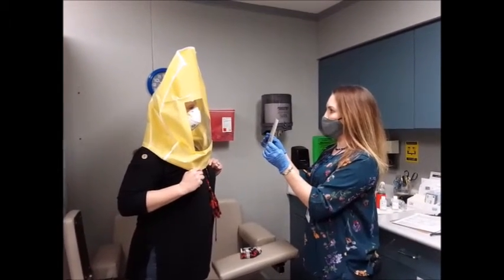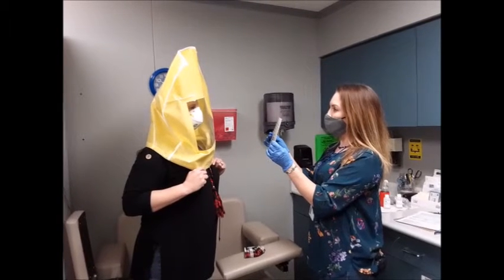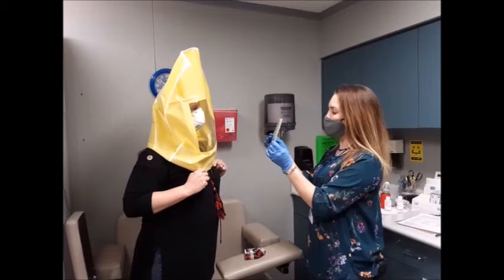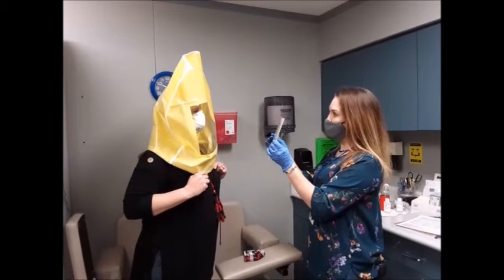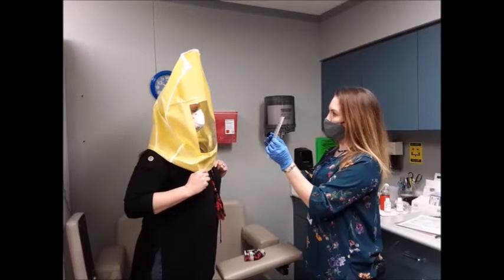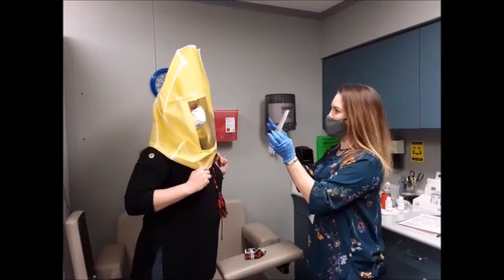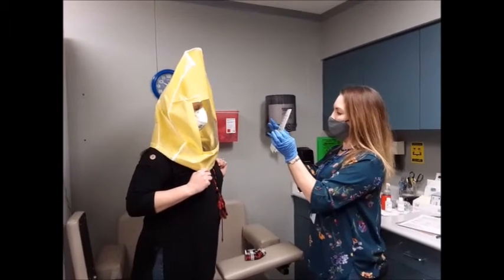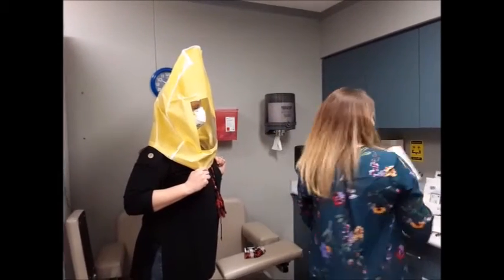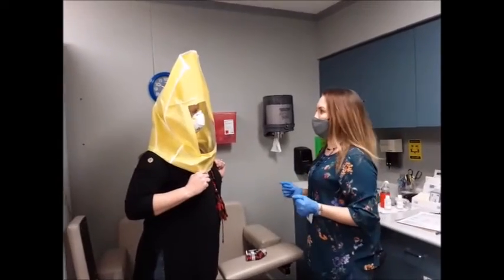I'm going to have you read this out loud: 'When the sunlight strikes raindrops in the air, they act like a prism. In front of a rainbow, the rainbow is a division of white light into many beautiful colors. These take the shape of a long round arch with its high above and its two ends apparently beyond the horizon.' There is a clip in it. Anything at all? You don't taste or smell anything?